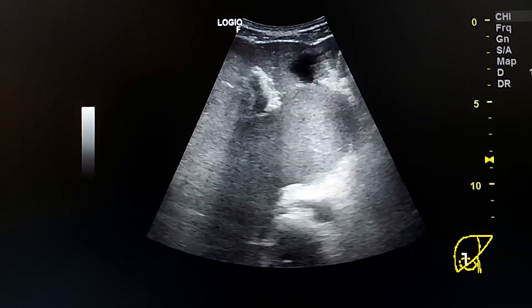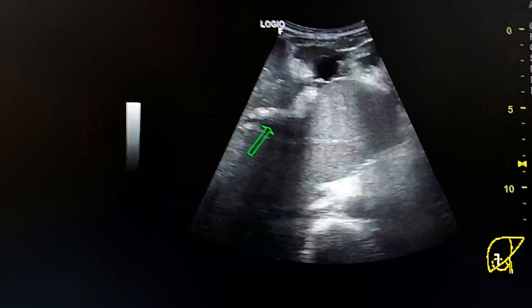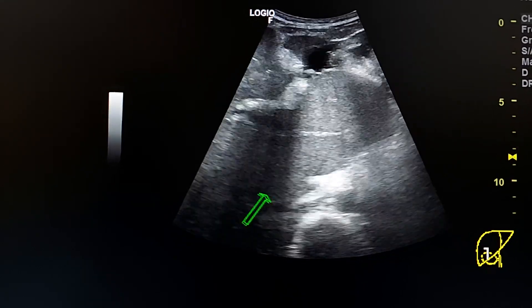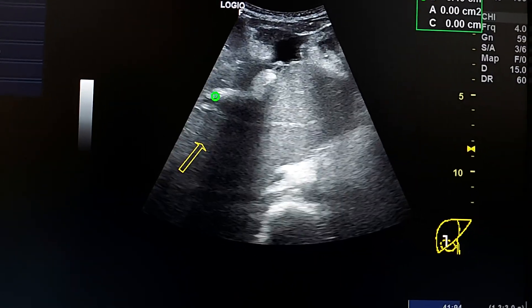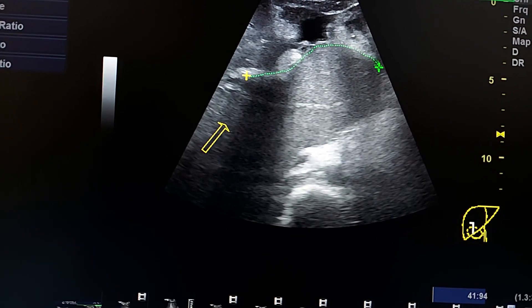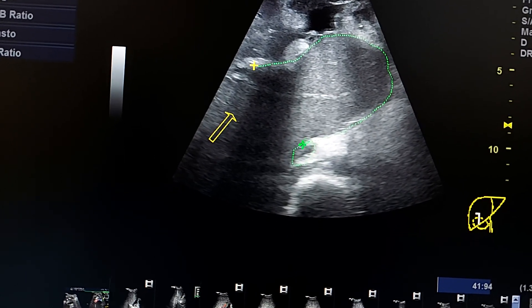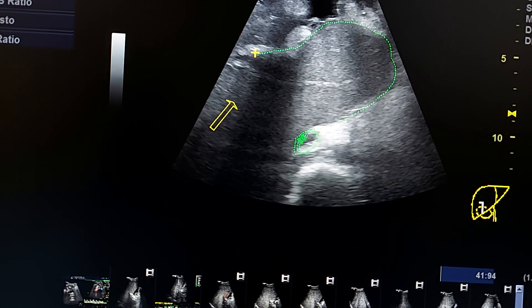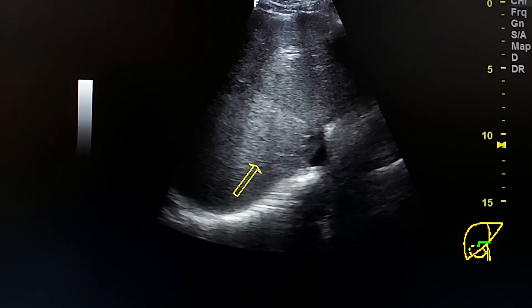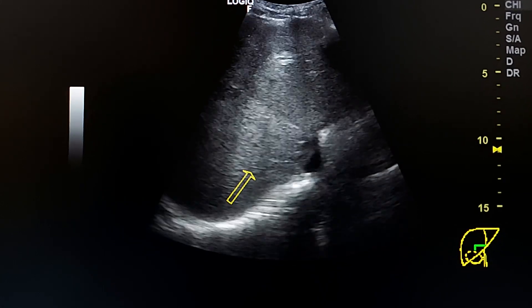Here we see the large caudate lobe. These are the contours of the caudate lobe, which is enlarged. This is the caudate lobe. Here we see the IVC, and here in this transverse section we see the IVC.